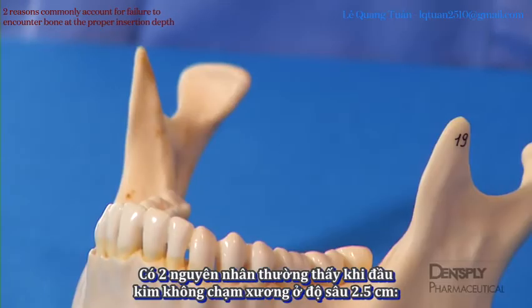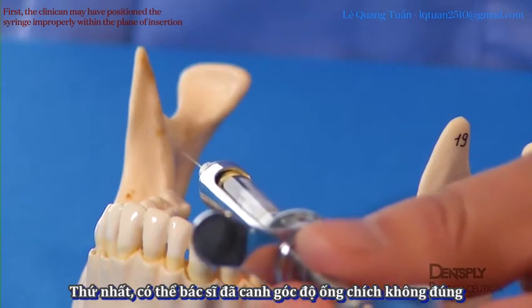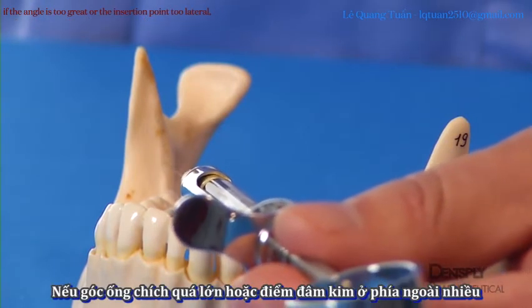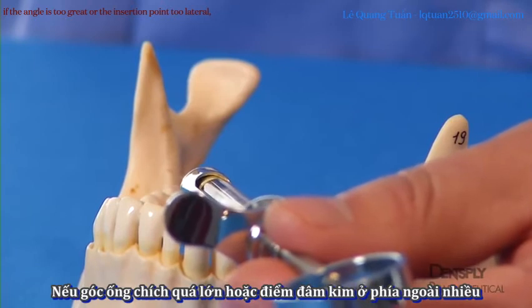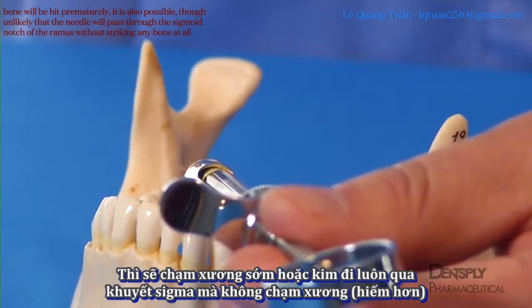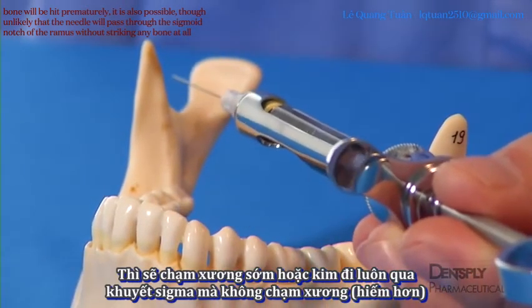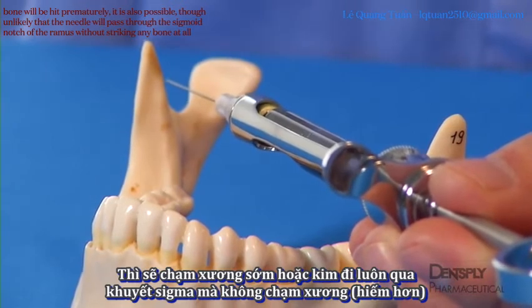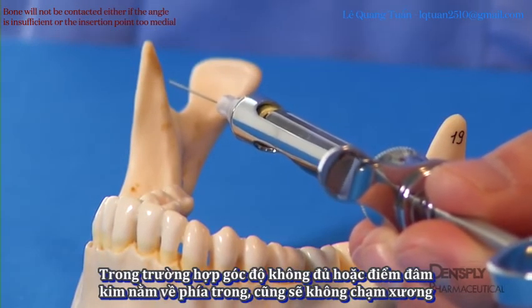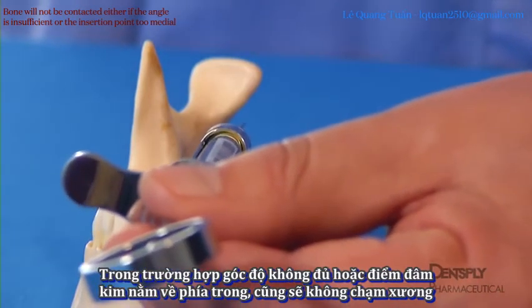Two reasons commonly account for failure to encounter bone at the proper insertion depth. First, the clinician may have positioned the syringe improperly within the plane of insertion. If the angle is too great or the insertion point too lateral, bone will be hit prematurely. It is also possible, though unlikely, that the needle will pass through the sigmoid notch of the ramus without striking any bone at all.